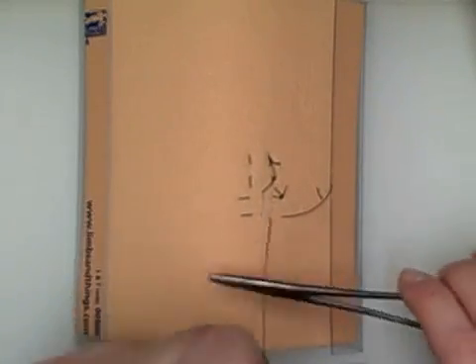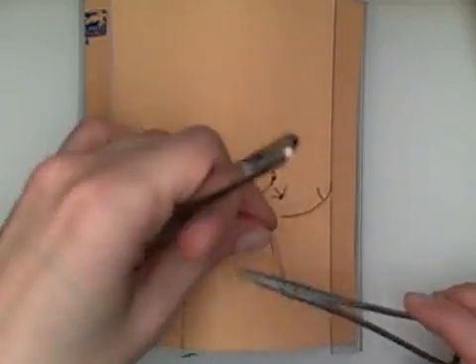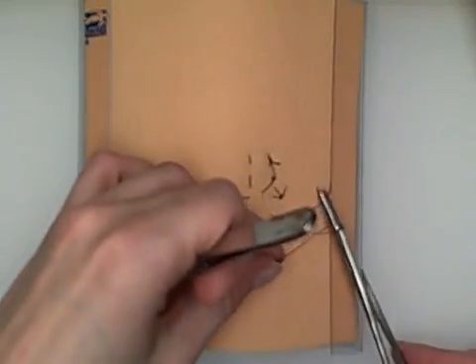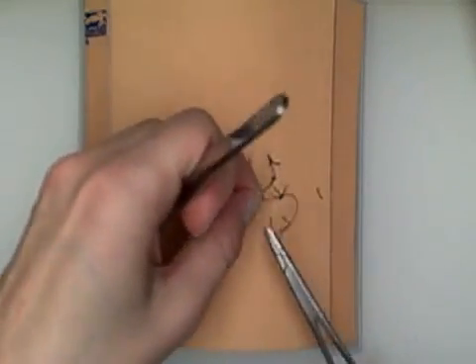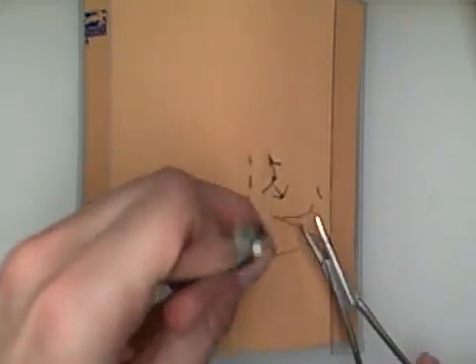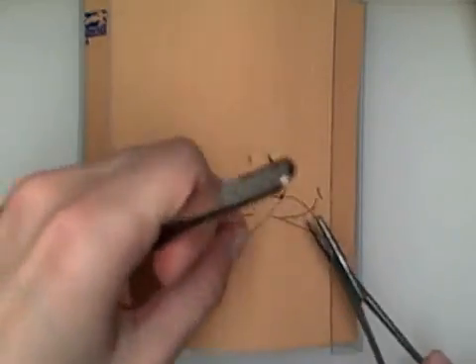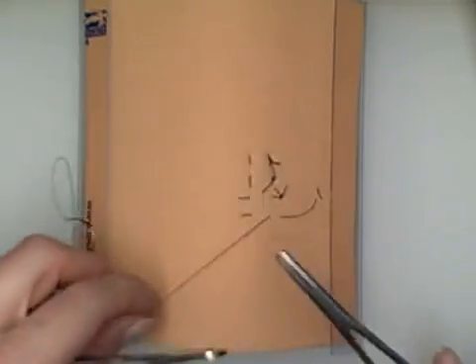Okay, so we're going to do an instrument tie here. I'm locked in my needle driver.